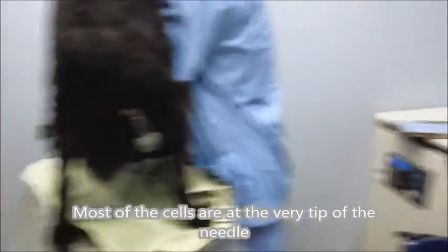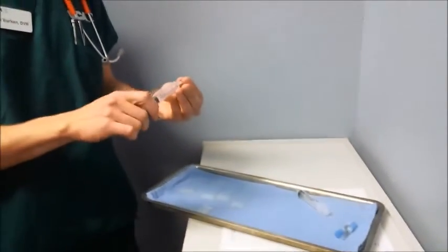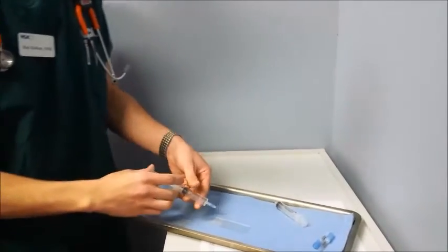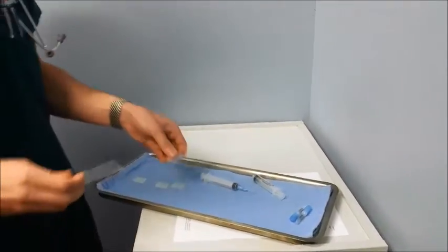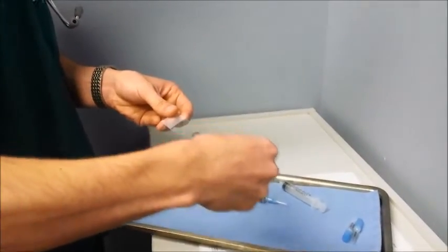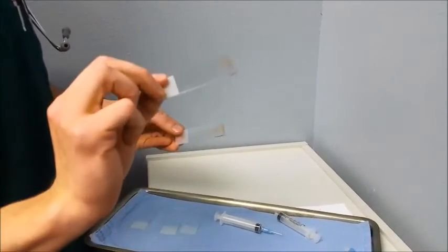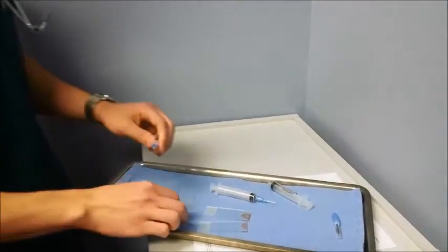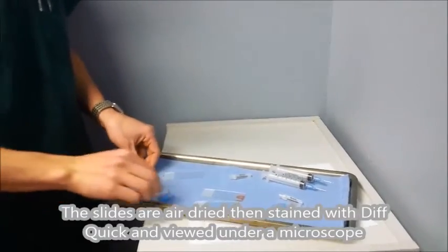We've got the cells in the hub of the needle. I'll go ahead and take a six mil syringe, make sure the bevel's angled appropriately, and apply a bunch of pressure — there, we've squirted some out. I like to take one slide, flip it upside down, and use that to flatten and smear the cells out. Let's go ahead and do that probably two more times, because some of these masses can be finicky or the cells can kind of hide.